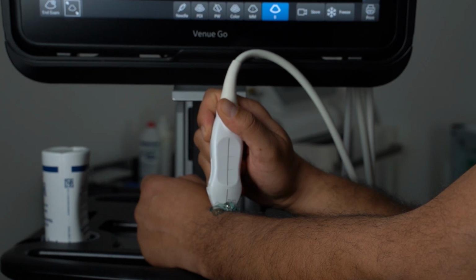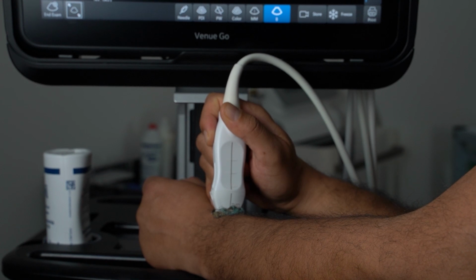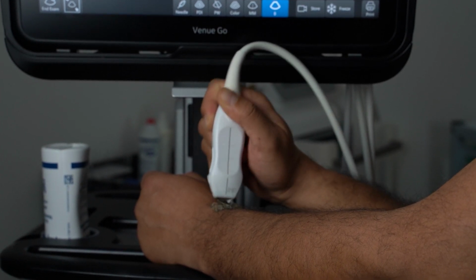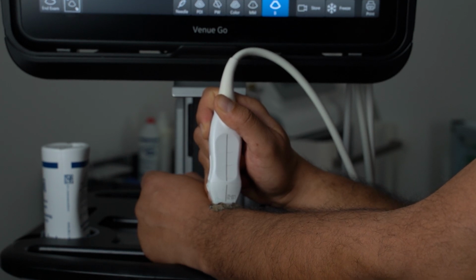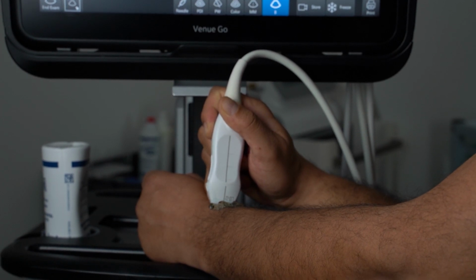So you apply that through onto the gel, the signal travels through into the tissue and starts to produce a signal on the screen. One of the disadvantages you can see is that we do actually have to touch the skin. So if you've got a very, very sensitive area, obviously it can be a problem if you've got somatization or sensitive skin for whatever reason. This does require touching, unlike some of the other imaging modalities where you take a picture but you're not touching anything. So just need to be aware of that.